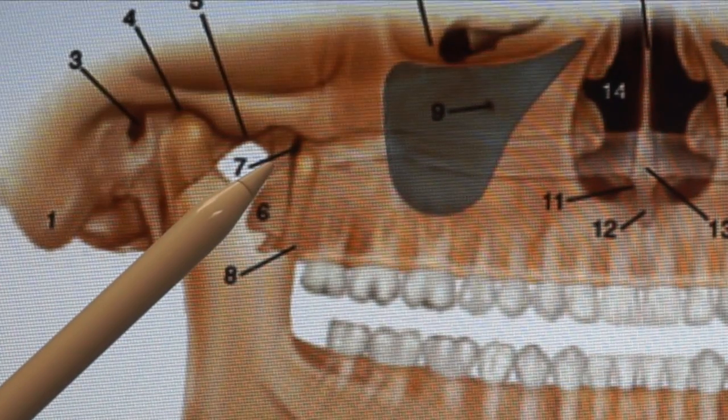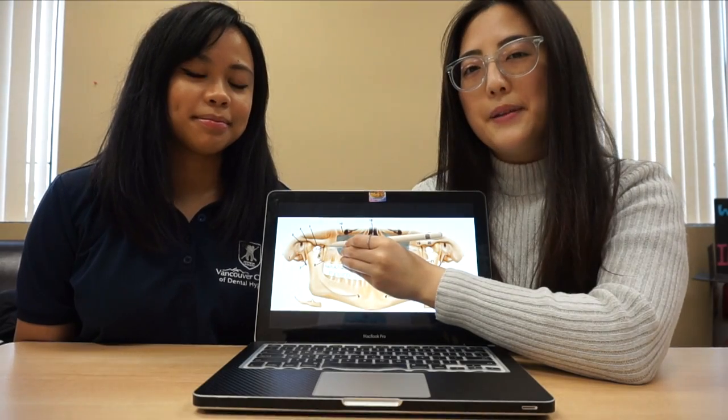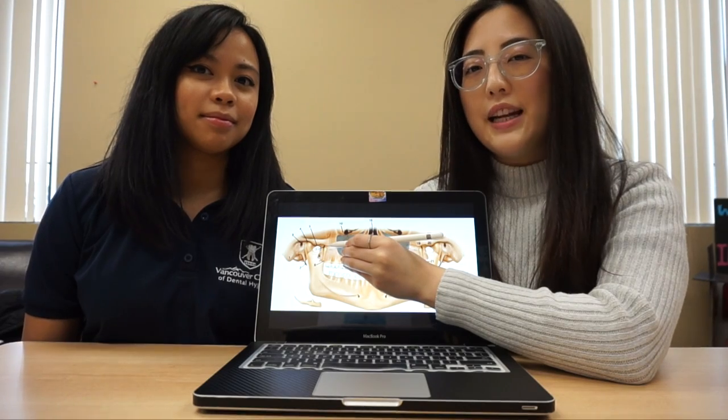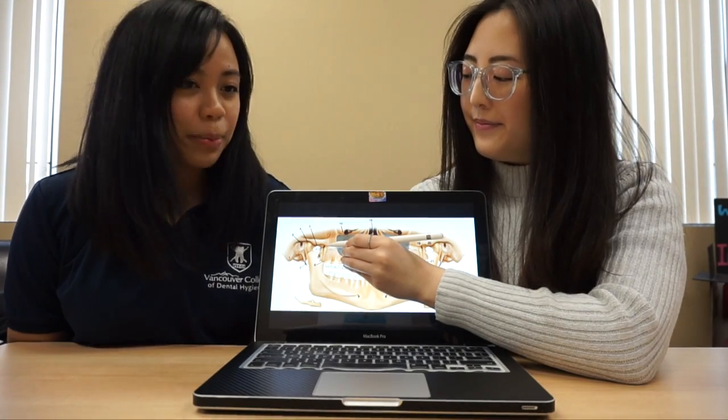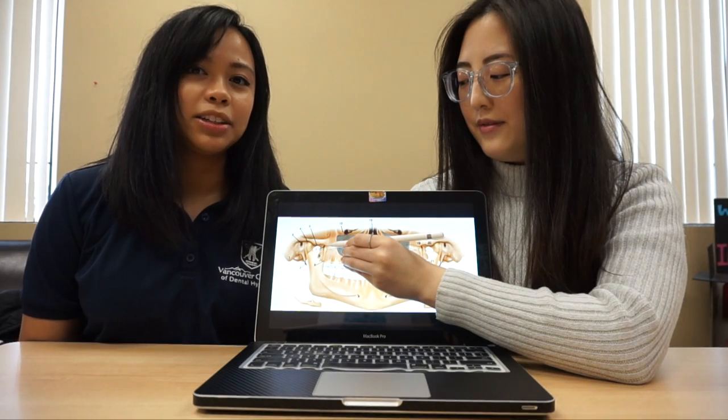This is our question. What is number 7? Number 7 is a narrow space that separates the pterygoid plate and the maxilla. It appears as a rounded radiolucent area. It is not seen in intraoral images.